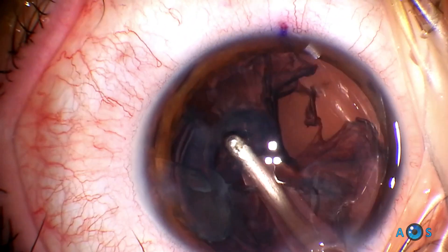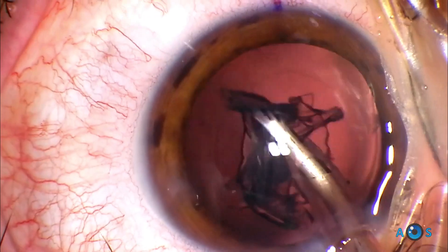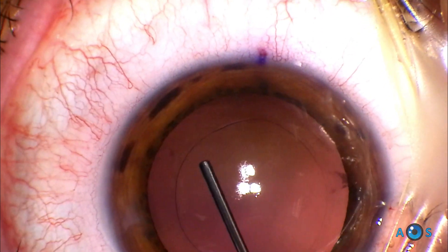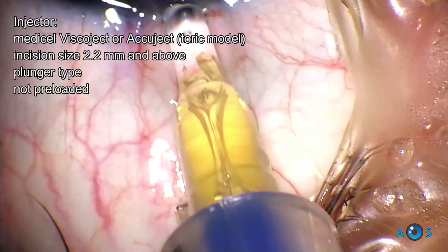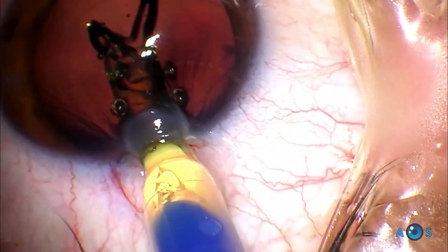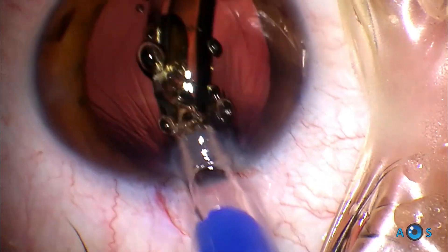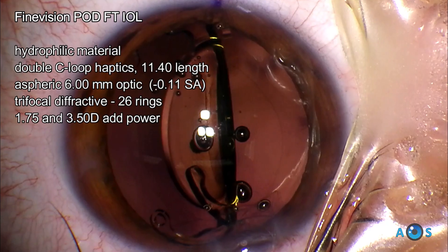Cortical material is thoroughly aspirated before proceeding with the IOL implant. The Physiol FineVision family of lenses are normally implanted using the Acuject injector, which is compatible with corneal incisions down to 2.2 mm. This is a plunger-type injector and it allows the IOL to be carefully delivered into the capsular bag. The lens immediately unfolds and the surgeon may simultaneously proceed with irrigation and aspiration of viscoelastic while adjusting the positioning of the lens in the capsular bag.